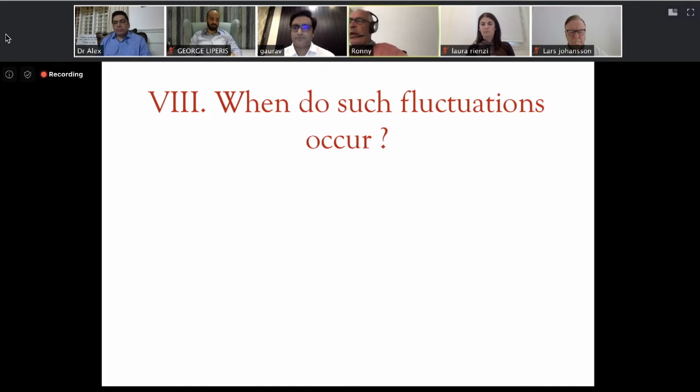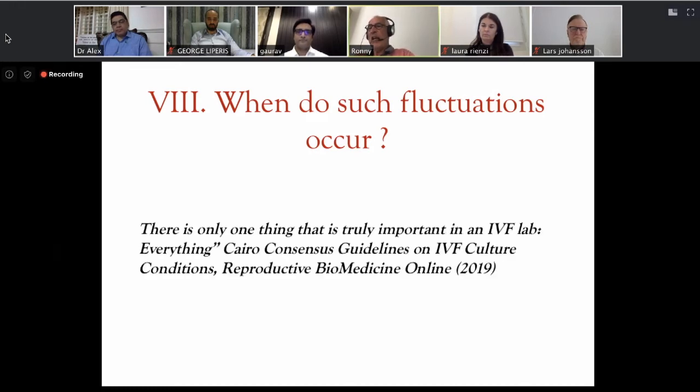Well, we heard many things to control in earlier contributions, but the point is, when you have a stable process in your laboratory, then there is no reason that if it's working today, it should not work tomorrow. If there are fluctuations, this means that something has been changed. When there are changes, it means your process is not in control.